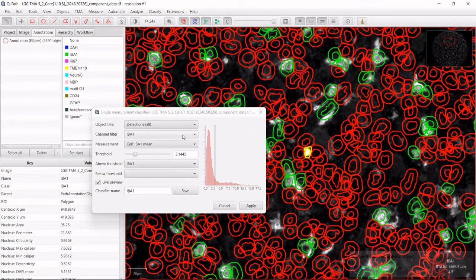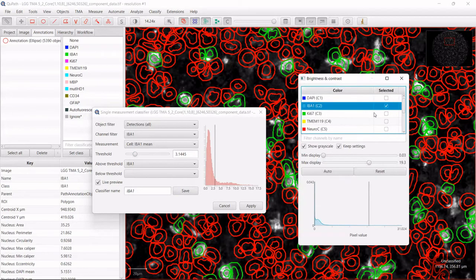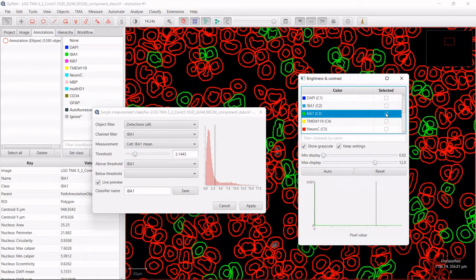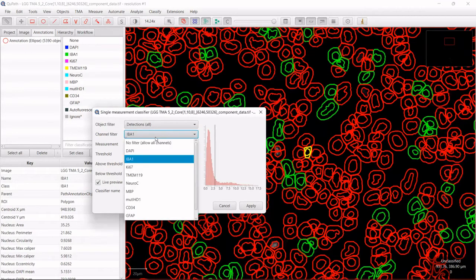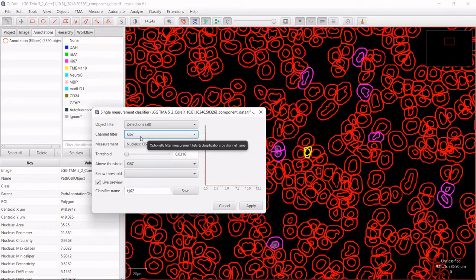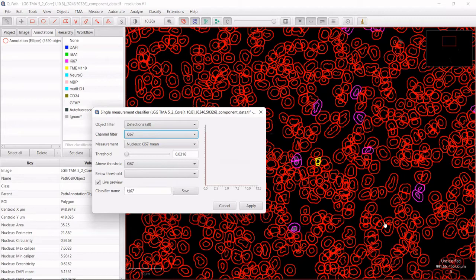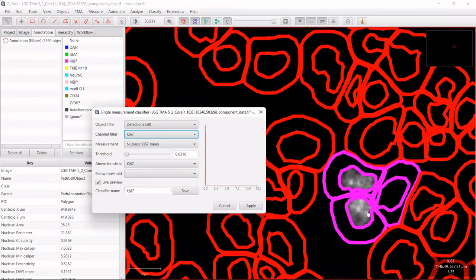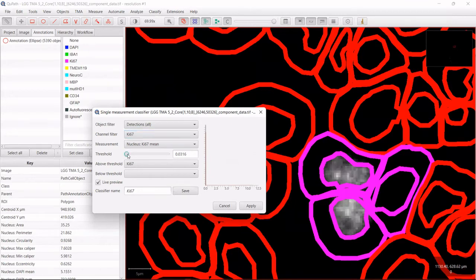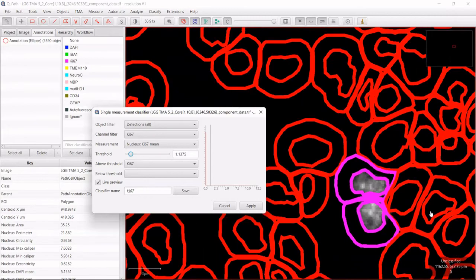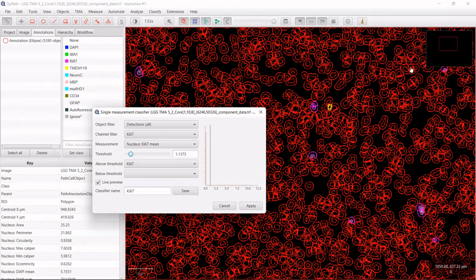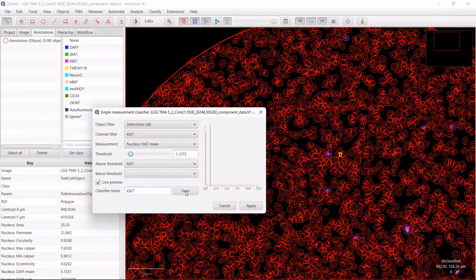Now we could do this for a second channel. I would like to look at whether cells are positive for KI67 or not. I switch to the KI67 channel and pick that I want to classify based on measurements in the KI67 channel. I look at a region that really expresses KI67. It already fills out automatically what we could choose, and I increase the threshold a bit. Now these cells are positive, these are negative. For demonstration I say I'm happy with that and save it.